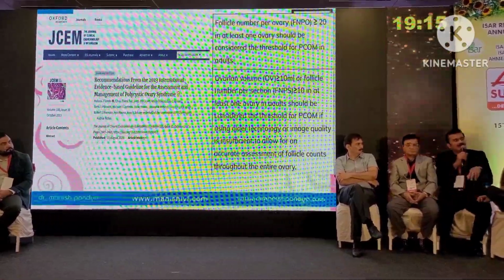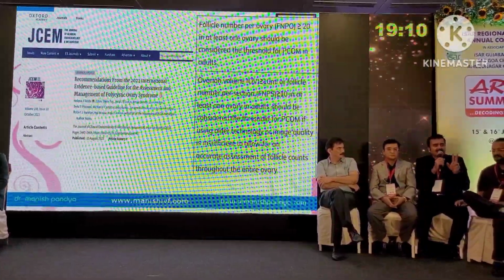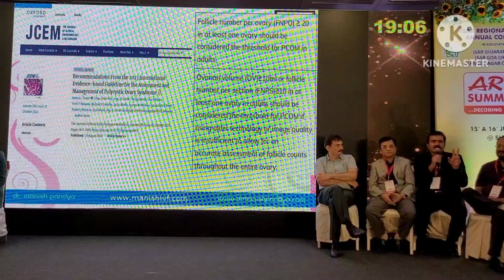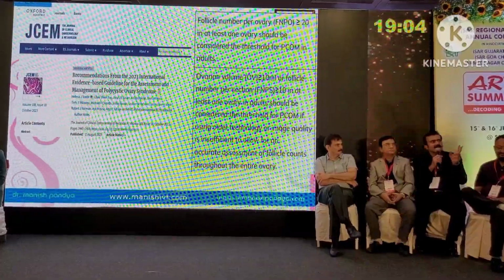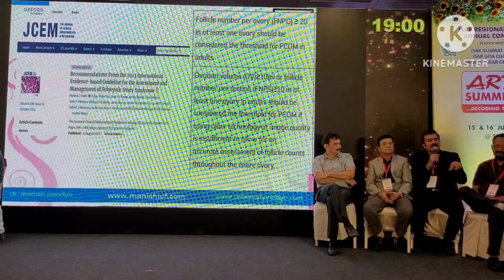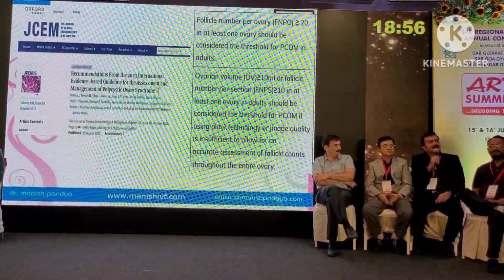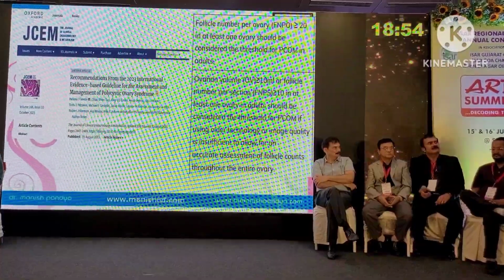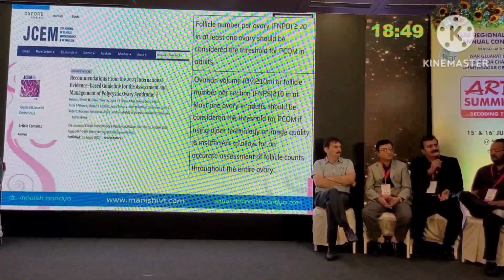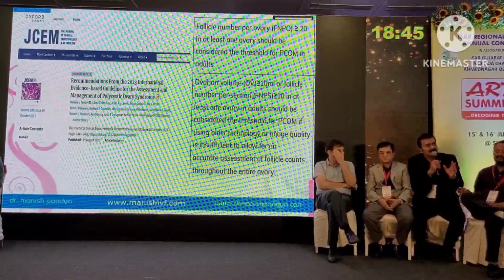When we see a PCO pattern in the ovary, it doesn't necessarily mean it's PCOD. Subclinical hyperprolactinemia and subclinical hypothyroidism are very common in PCO patients. It's not PCOD. That's why the nomenclature has now changed to polycystic ovarian morphology. So this is PCO, and this is the latest study: PCO pattern and PCOS or PCOD, there is a big difference between these two entities.